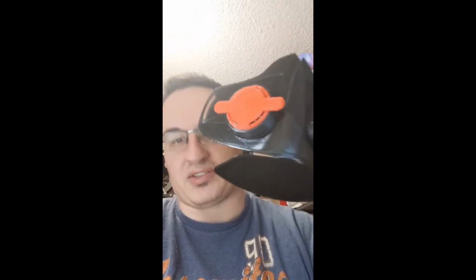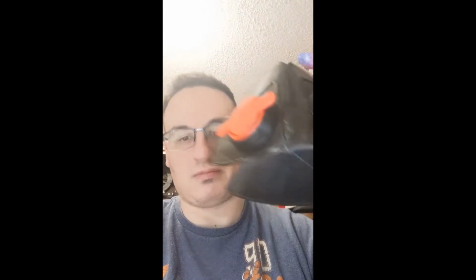So I think altogether, the print time with the mask and the pieces comes out to about 2.5, 3 hours. So for 3 hours worth of work, you're better off asking someone who sews with a sewing machine to make a dozen cloth masks, because those would breathe a lot better, be a lot more comfortable, and just a lot better overall fit, because you could fit those easier, and they breathe, so you would not have to worry about it. But Copper3D needs to revise this, because this is not acceptable for any medical application.